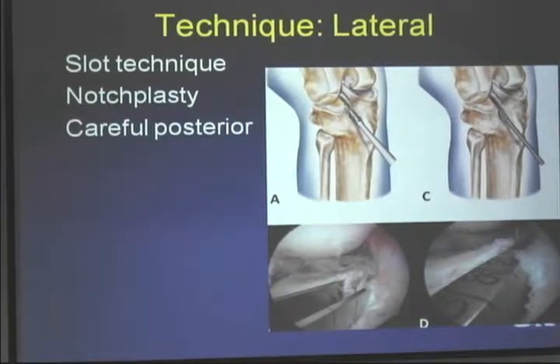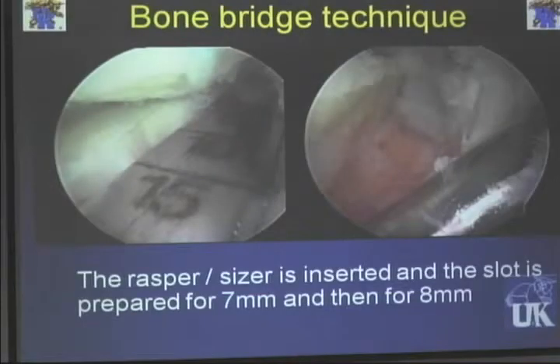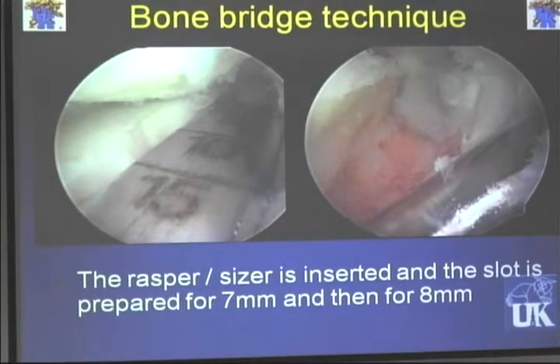On the lateral side, I think this is a little bit of an easier operation. You can do a slot or a keyhole technique. The horn sites are only a centimeter apart. The only thing you have to be a little bit careful of is going posterior, because the neurovascular bundle lives directly behind the posterior horn of the lateral meniscus. If you go straight back, you're going to get into trouble, and it is going to be here on the lateral side. As you're going backwards, you want to make sure of the neurovascular bundle, which lives back here, so you have to be careful going back there.